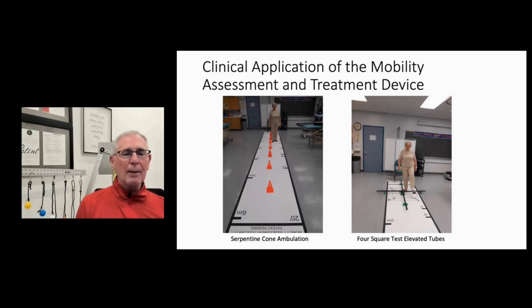Those both, if you ever stepped on something round and wooden, you can turn your ankle or you can even result in a fall. Here, if they step on a golf tube, it's plastic, it flattens it. And if they ruin it too much, you just get rid of it and get a new one. So I prefer those as a safety feature much, much more than I do the original wooden canes or the PVC. In this case, we're using the blocks here, mega blocks, or there's brand names to those blocks, but these sit about an inch and a quarter high. So you can now make it a challenge for the person to step over.